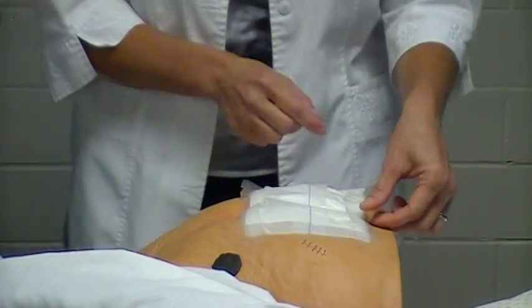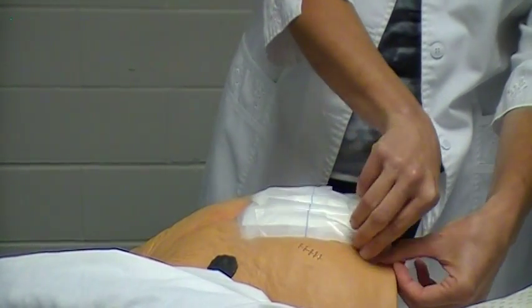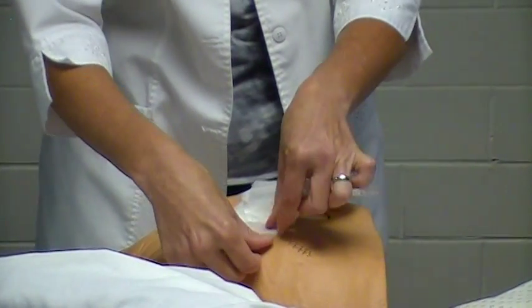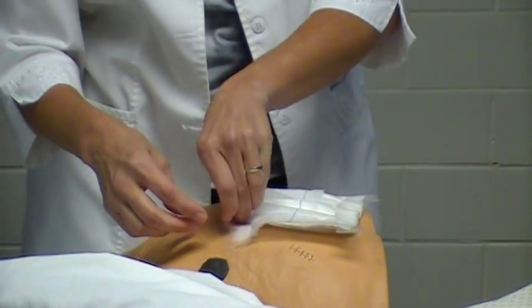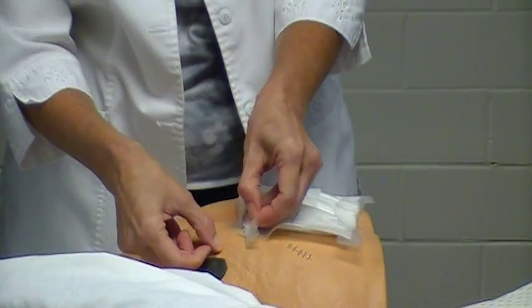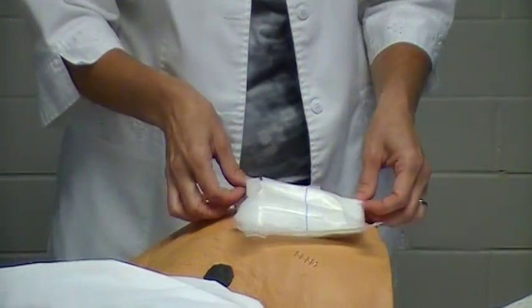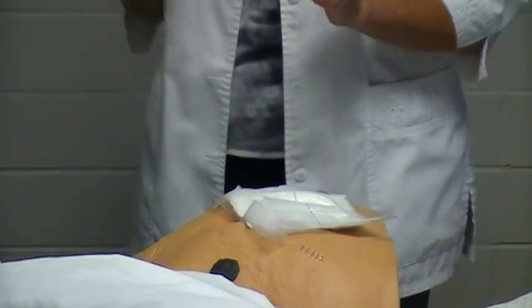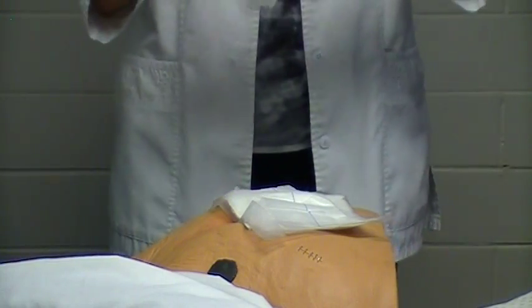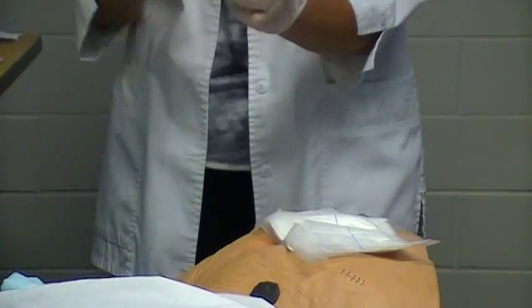And if you notice, I'm pulling the tape even with the skin, I'm not pulling away from it. That helps loosen the tape without damaging the skin. And once again, you can use an alcohol pad if you need to. Now, at this point in time, I would put my gloves on because I'm going to actually take the old dressing off. Now, these are my clean gloves that I'm putting on at this time.